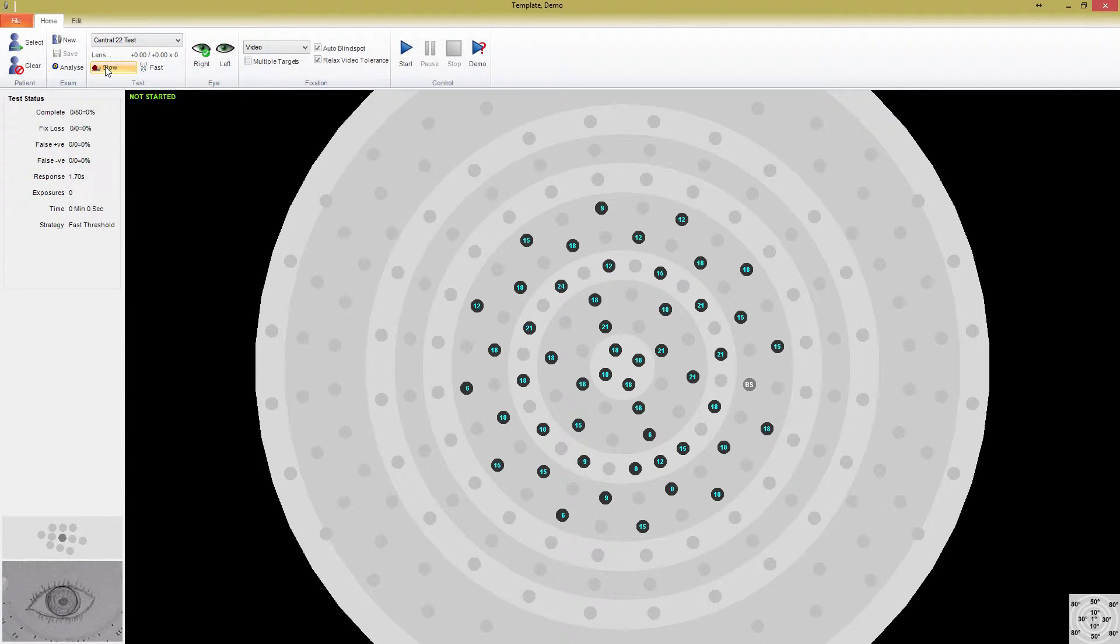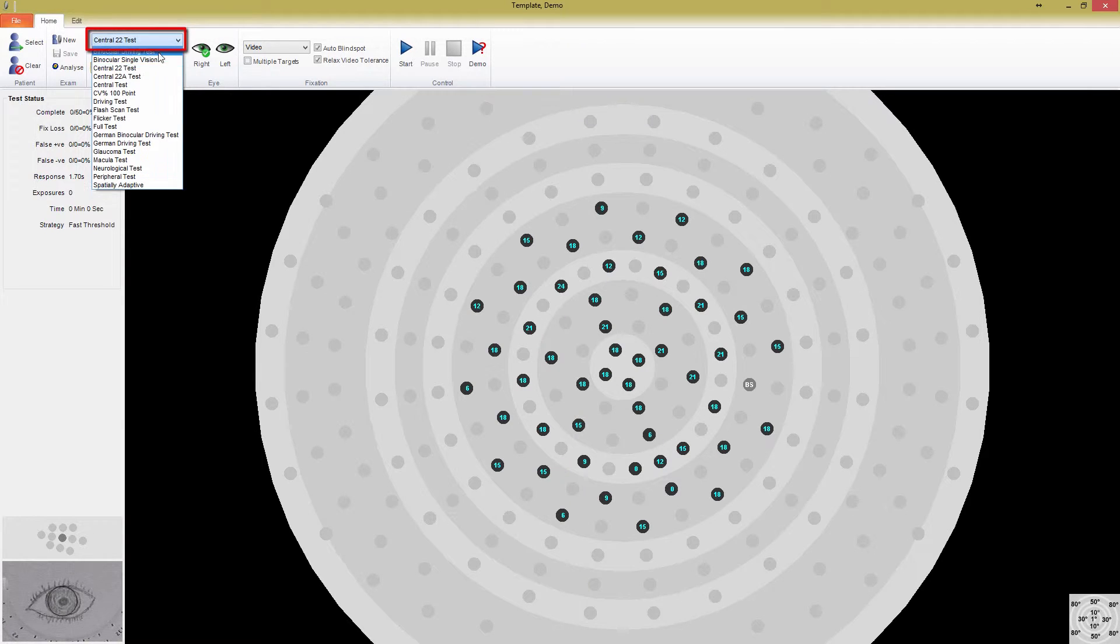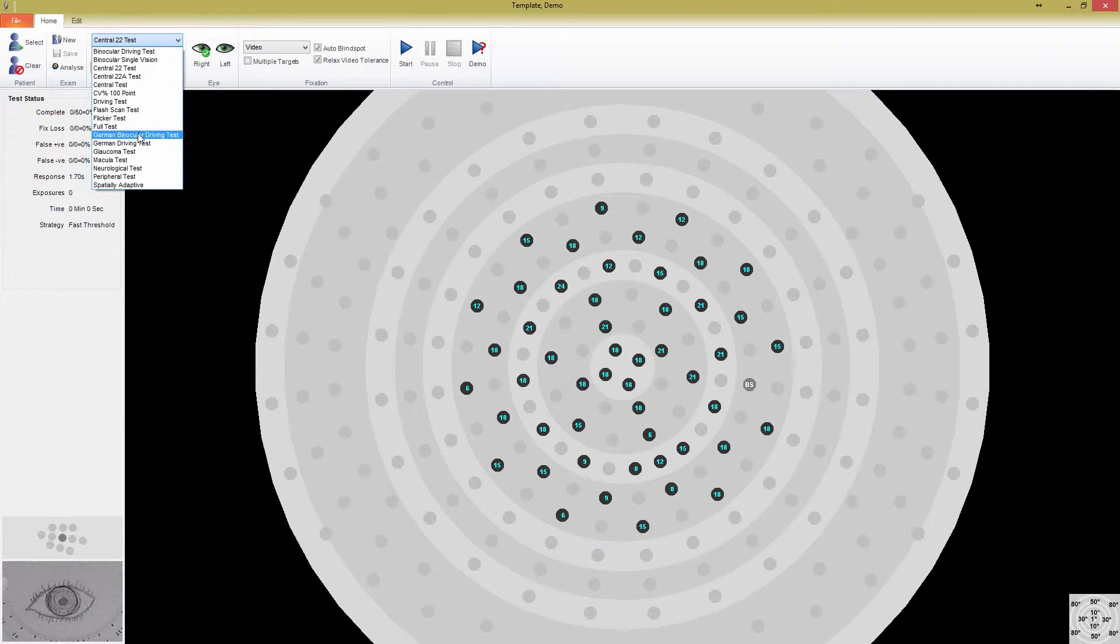The stimuli presentation is adaptive and will speed up if the patient is responding quickly. This can assist in reducing the testing time. Above the speed controls is a drop-down box containing all of the available test templates. It starts out with only the pre-built templates included in Medmont Studio, but any tests that you build and save for yourself will also be added to this list.